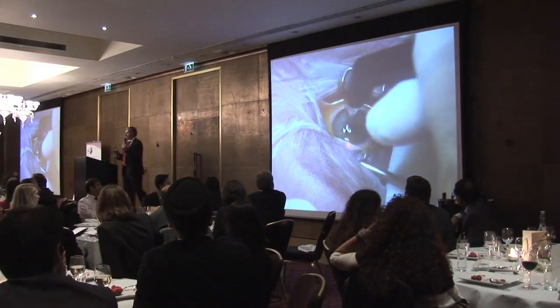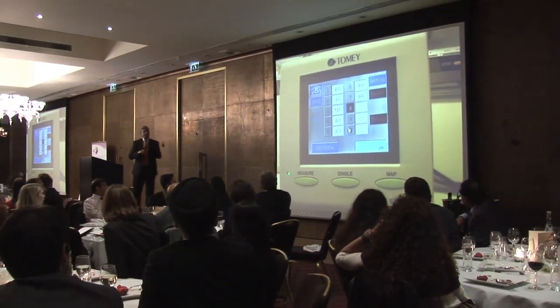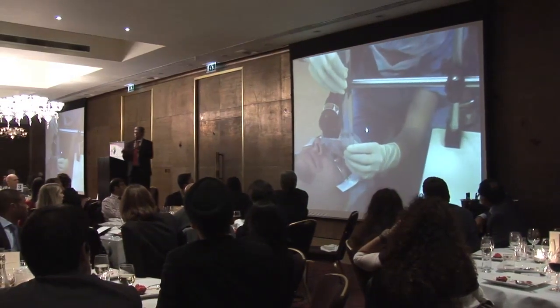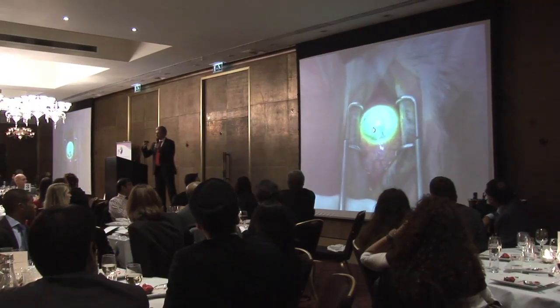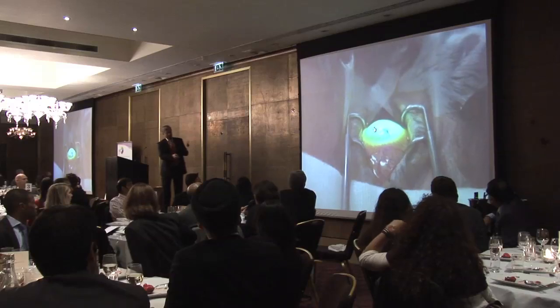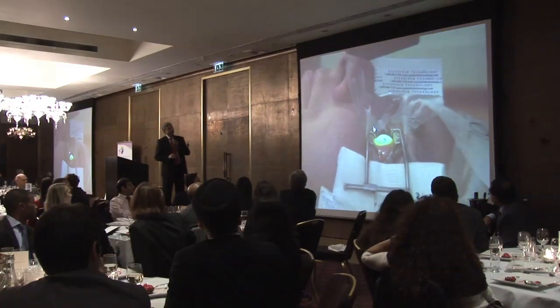We want the cornea to be at least 400 microns, because if it is less, there would be danger for the corneal endothelium, and it can be damaged by UVA. So there are new protocols, and maybe it's a good idea, in case the cornea is thinner than 400, to decrease the time of irradiation. And this is already irradiation by UVA light for 30 minutes normally, and that's it.